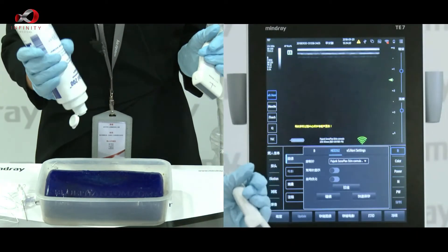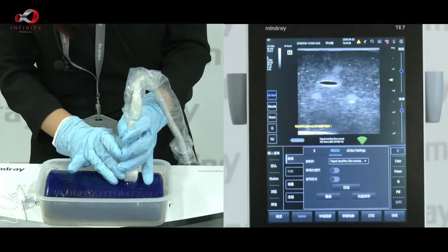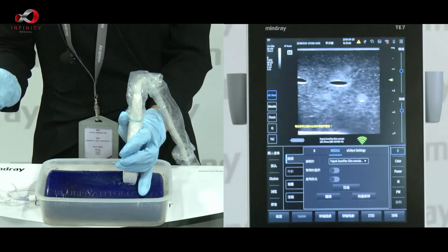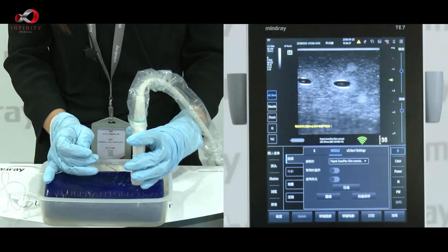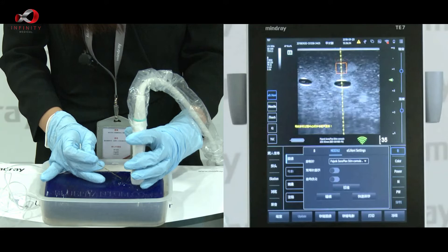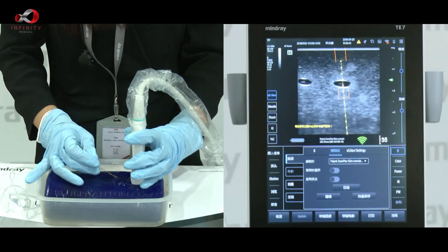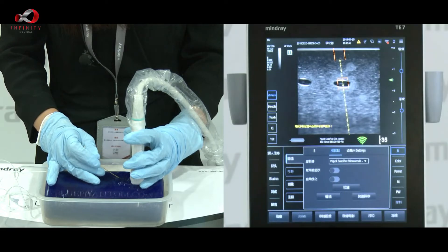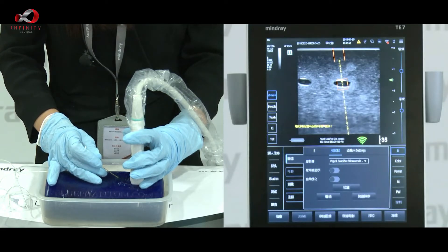So we put some gel on the phantom first. Now on the screen, try to find a target. Use the one-motion approach method — gently prick the needle tip on the superficial layer of our phantom. Then we can adjust our needle up and down for changing the depth, and right and left for changing the angle. Once we put the target box on the target, we can start to push our needle forward.